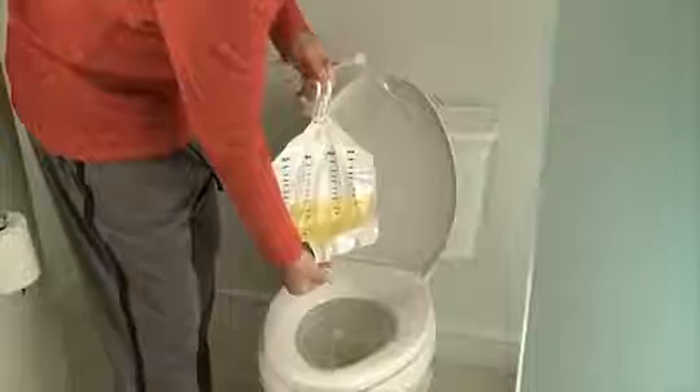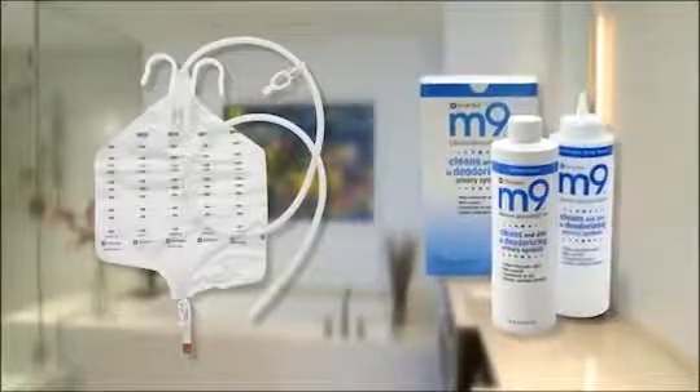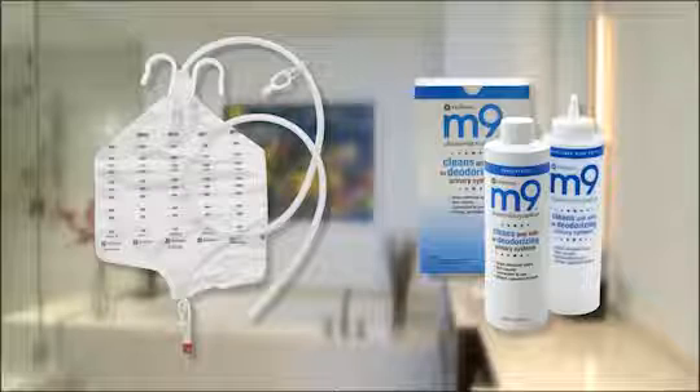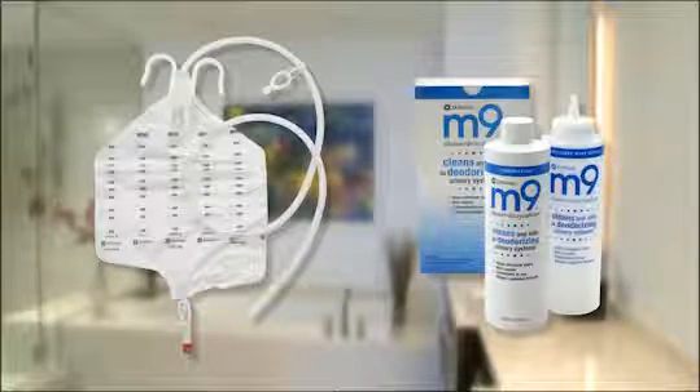A nighttime drainage bag can be reused. After each use, simply disconnect the bag and empty the urine into a toilet. An easy way to clean your nighttime drainage bag is to use m9 cleaner decrystallizer, which comes with a convenient wash bottle. This is more convenient than products like bleach or vinegar.